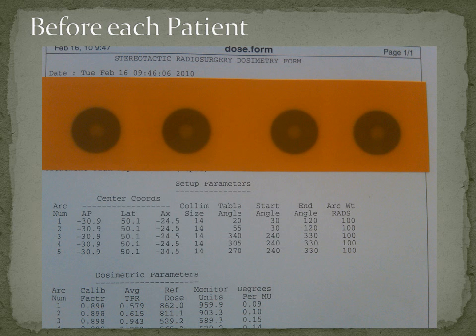Today we have 5 radiosurgeries. We'll do this test 5 times. And then also, we have a list that we use that's going to run us through the procedure. We think those are 2 very critical things in our procedure. One is that we actually have a list, and all those of you who've read the Checklist Manifesto realize how important it is to have a procedure like that.